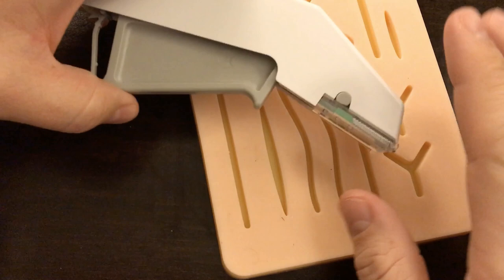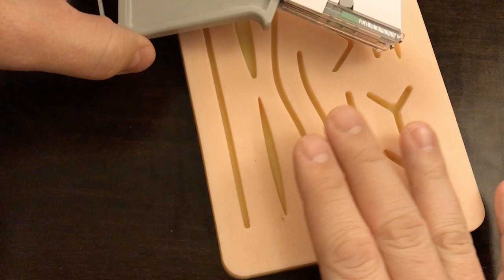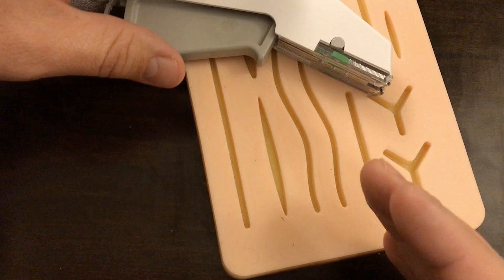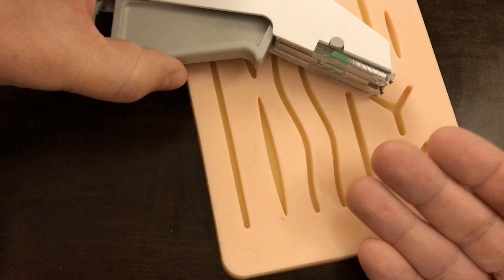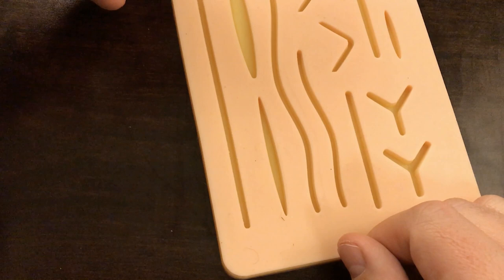Before you go ahead and place the staples, you want to make sure you've done all the same wound cleansing and preparation that you would do if you were suturing. That includes irrigation, making sure there's adequate hemostasis, and exploring the wound to ensure there are no retained foreign bodies. Then after placing the staples, do the same aftercare — maybe a little Bacitracin ointment or Vaseline petroleum jelly with a sterile bandage on top.